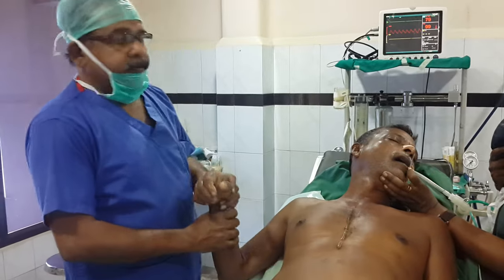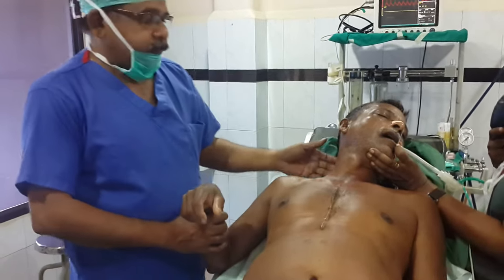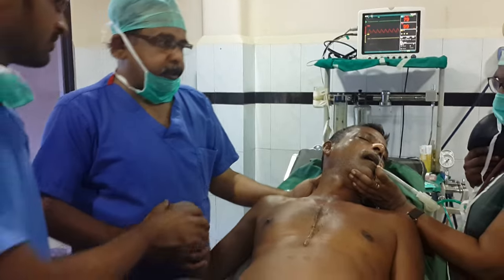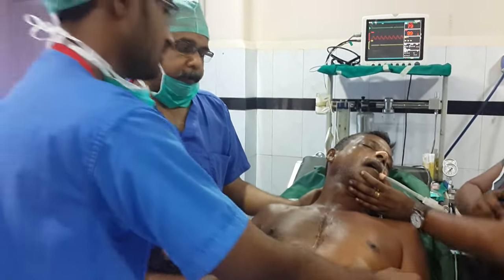You have to keep the patient in sitting position, keeping your anesthesia endotracheal tube protected.